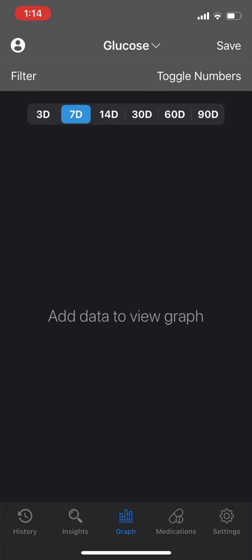Data control and security, there isn't a profile section. You can download data though. I don't believe I had to put my name in it anywhere, so as far as someone stealing your data, I don't think they could take it and relate it to you in any way unless you were to get the plus features. So for security, I'll just give it a 5 because I just don't think there's much that you can take in the first place.